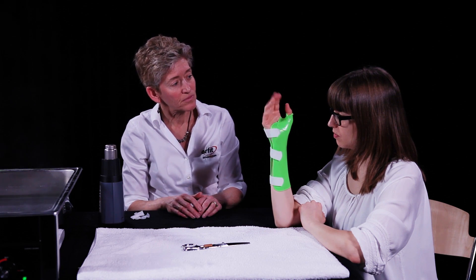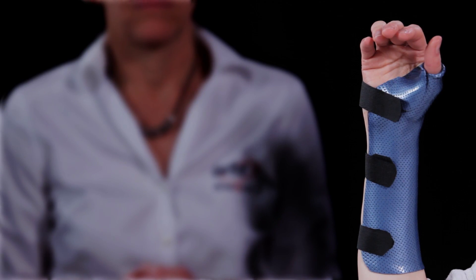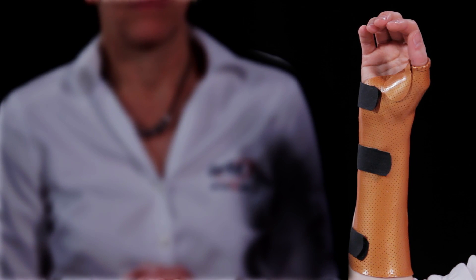Using Orfit Colors NS in all eight color choices allows you to make bright and bold therapeutic orthosis which your patients will enjoy wearing.